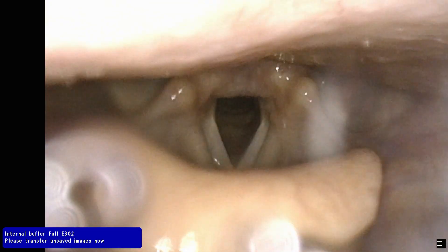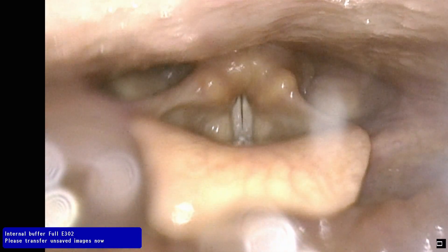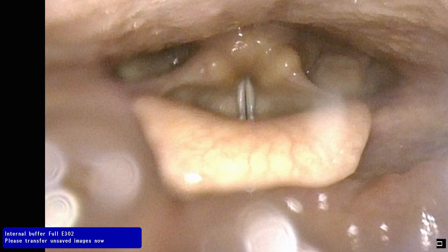So just hold out that E at a comfortable pitch for me again. You can see them vibrating there. Vibration does look pretty good. What you'll notice is maybe a little bit, the epiglottis kind of pushes back to cover the view of the vocal cords just a little bit, right? And that is because it's connected to your tongue — that is a sign that you're engaging your tongue just a little bit. Not very much at all, but just a little bit.